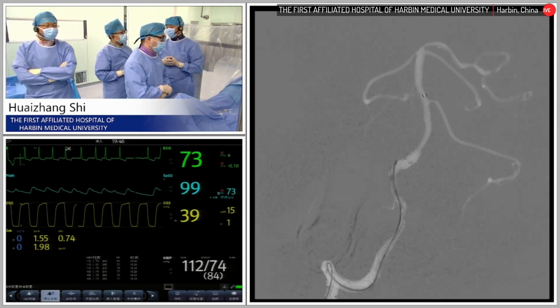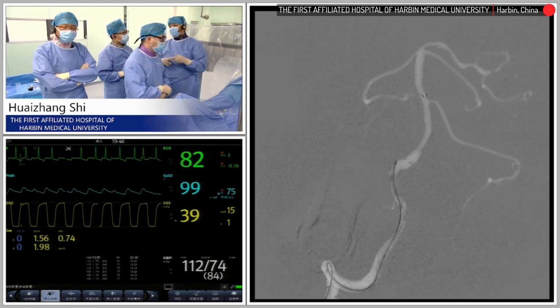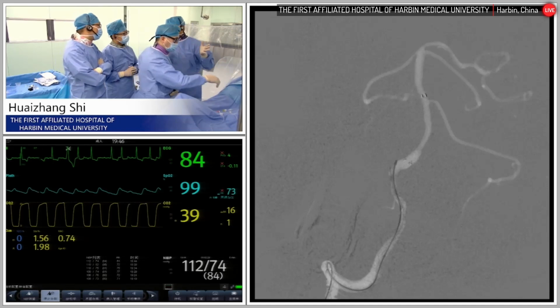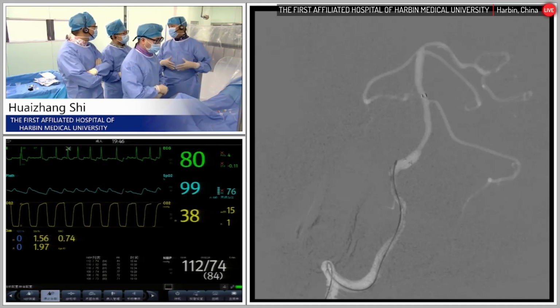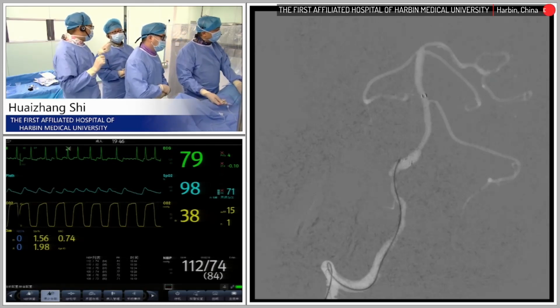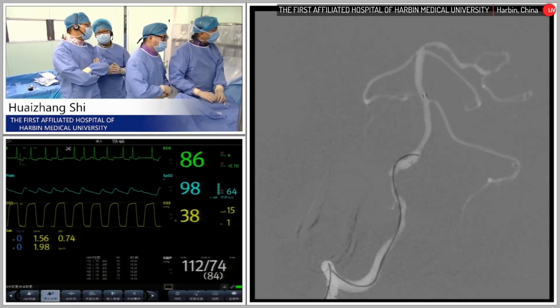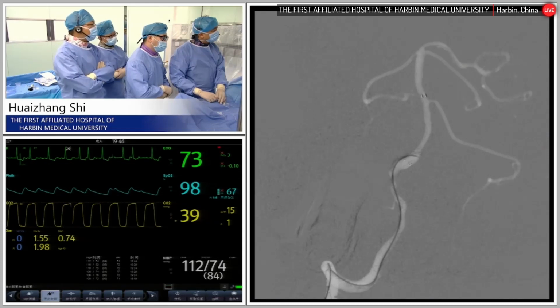If we use the self-expanding stent, the balloon can be a small one, matching the distal segment size, and the stent a larger one, matching the proximal segment size. If we choose a large balloon, the distal part may rupture. If it's small, we cannot do the post dilatation. So most of the time we choose the self-expanding stent. It's safer.